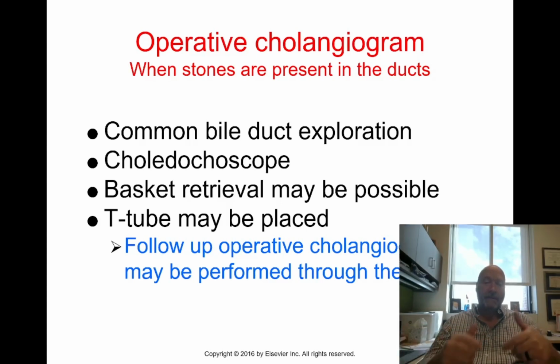If they've still got stones and the bile can't go down into the small intestine, it's got to have a place to go. It could be that so much pressure has built up on that stone that we've got so much swelling that the stone can't move. So placing the T-tube into place gives the stones a place to go, the bile a place to go. Some of that swelling can come down, and the stone may move either down into the small intestine or back out through the T-tube. So it relieves the pressure and reduces all that.